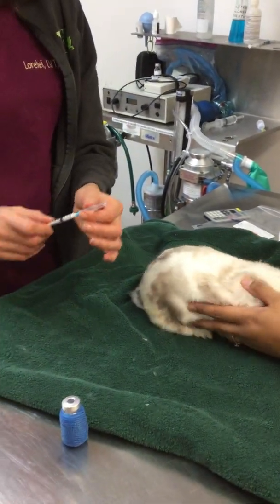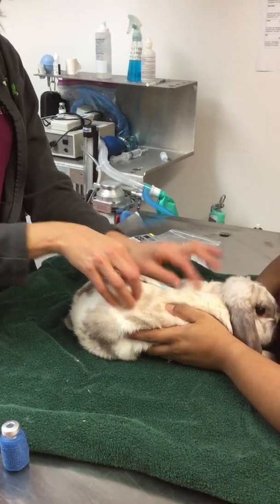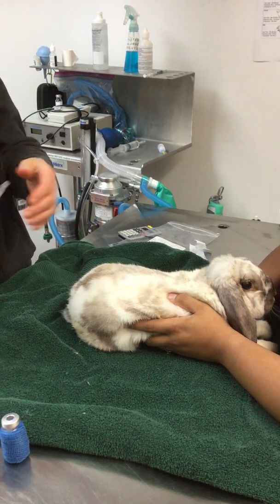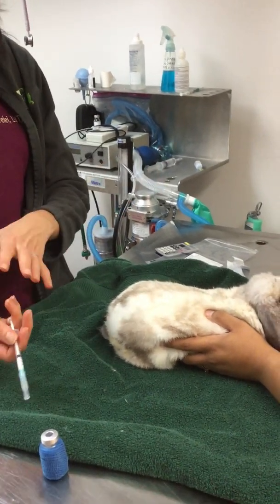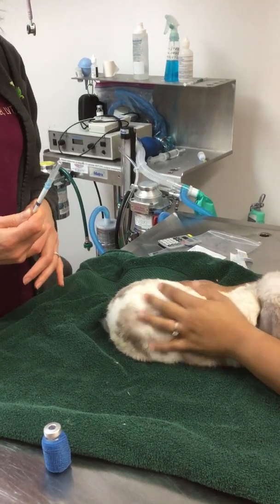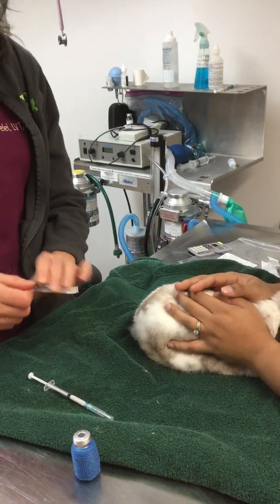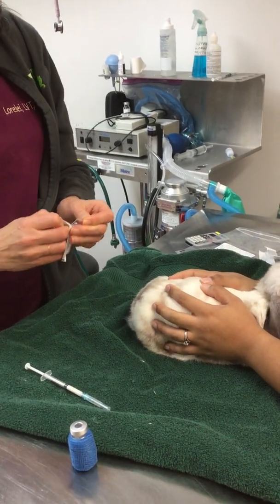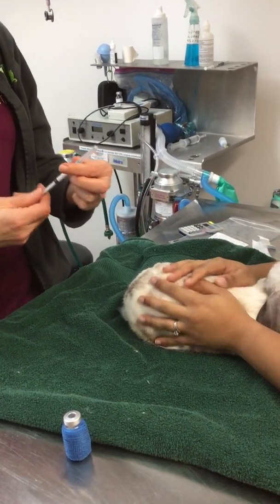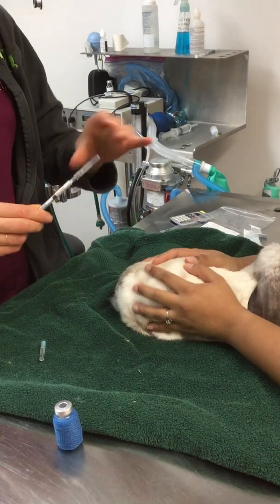Now you have two choices at this point. I can either directly inject this right into the bunny, or I can change the needle. I prefer changing the needle because even though I only went through one soft rubber tube — the entrance — it can still dull it a little bit. So I'm going to change the needle. That does mean you have to buy twice as many needles, but that is my preference. You don't have to — it's okay if you don't, usually it's fine. But this is my preference.